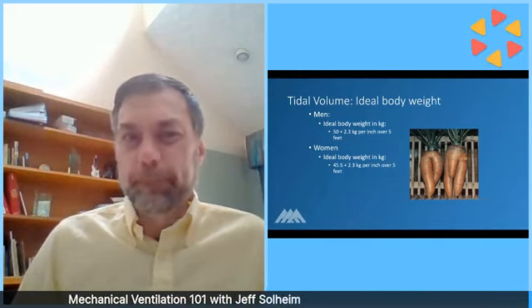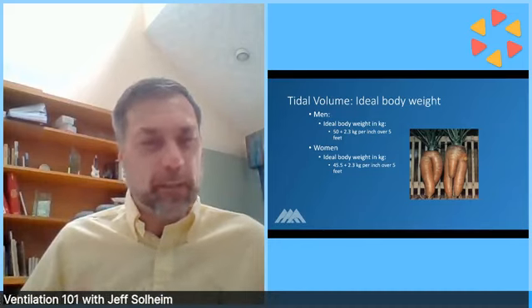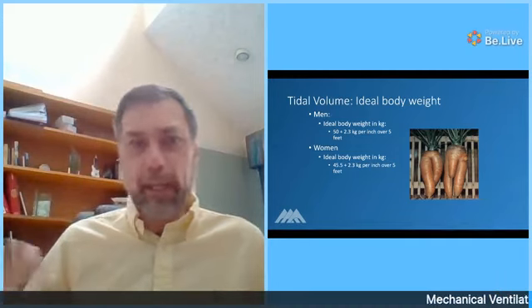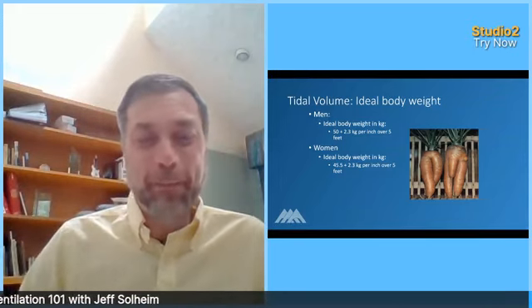That's getting pretty specific. When I'm intubating somebody, I kind of eyeball them. What do they look like they weigh? I multiply that by 6 and I kind of figure out what the tidal volume should be. But those are the mathematical equations on the screen that you can use if you want to be really exact. And then we end up rounding it up anyway.